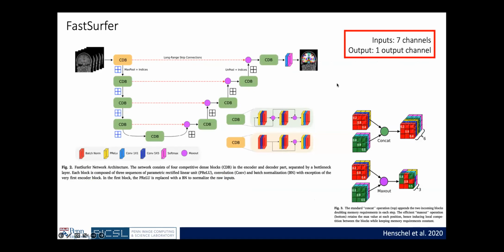So, okay, so far, all the segmentation networks, especially for medical images, that we were seeing train the networks by using patches from the images, right? Because it's such a large 3D image, you can't fit your entire 3D image in one go in a GPU. So you take patches and then you train your networks.